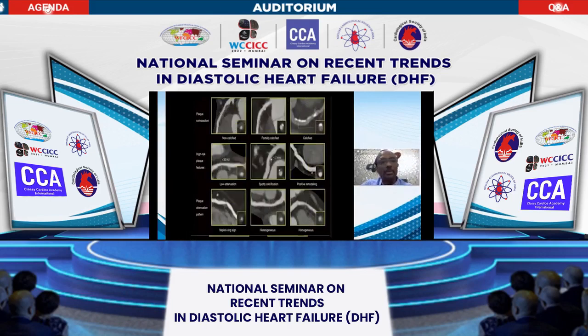We have become extremely good with plaque composition and high-risk plaque features. I'll just highlight the high-risk plaque features. Most of the high-risk plaques, or the so-called vulnerable plaques, are low in attenuation, that is less than 30 Hounsfield units. They do have a spotty calcification, which makes the matrix very friable, and the base of the vessel is remodeled and it becomes wide. So the constellation of positive remodeling, spotty calcification, and low attenuation plaque, which has now been very famously called the NRS sign or the napkin ring sign, is the one which we have to look for, even in the presence of a non-obstructive lesion.